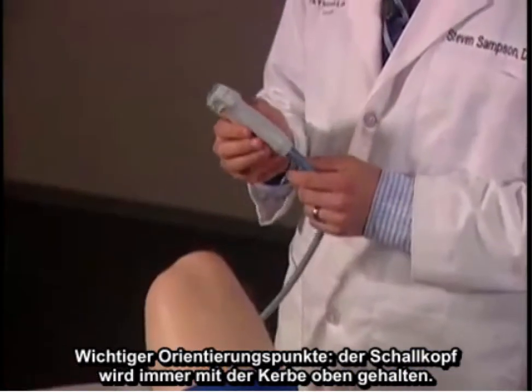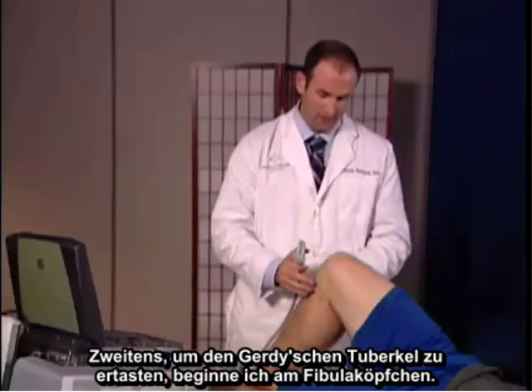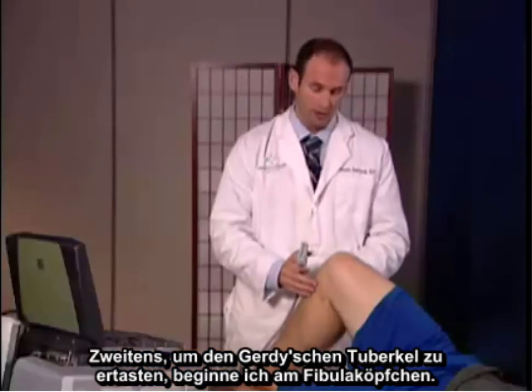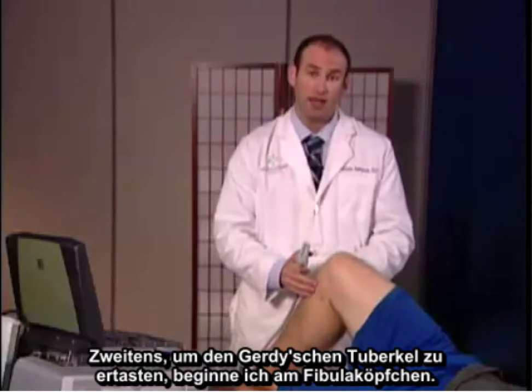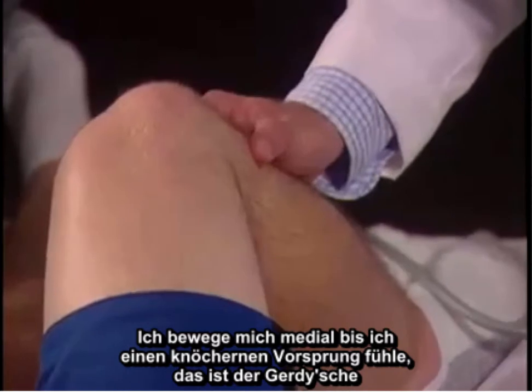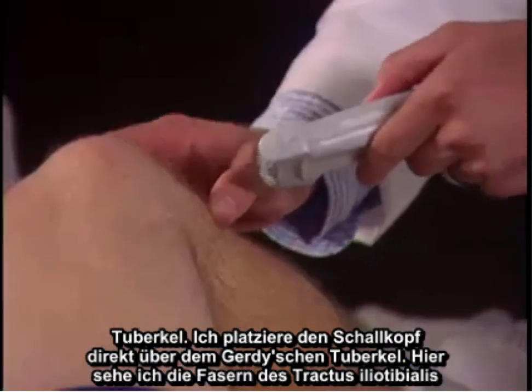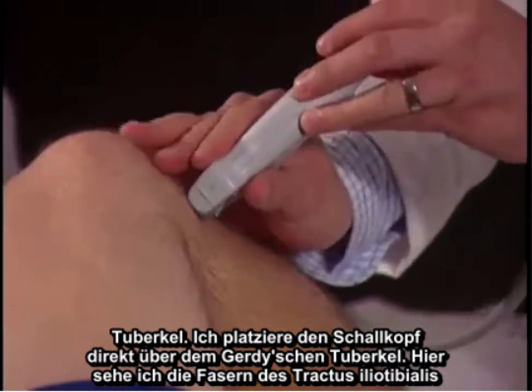Important landmarks: the transducer will always face superior with a notch. To palpate Gerdy's tubercle, I begin at the fibular head and move medially until I feel a bony protuberance, which is Gerdy's tubercle. I'm going to place the probe directly over Gerdy's tubercle.